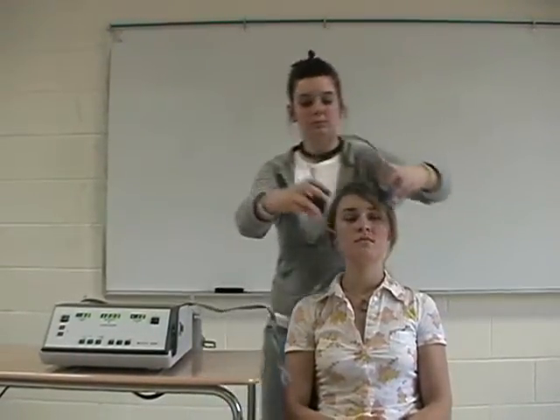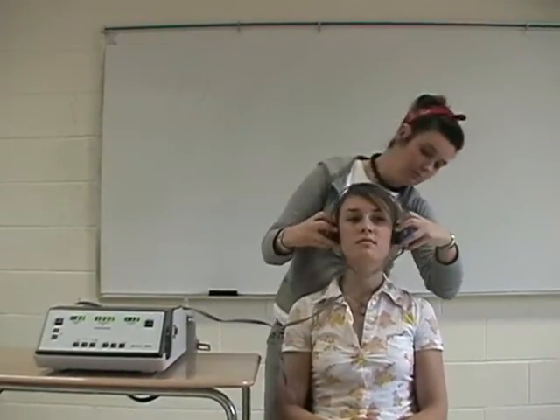These are your headphones that you use for the pure tone audiometer. These ones are used for bone conduction, and these ones are used for air conduction. The blue side is for the left ear, and the red side is for the right ear. This is how you comfortably put the air conduction headphones on a patient. Then you tighten the tops by using your index fingers to push it down.